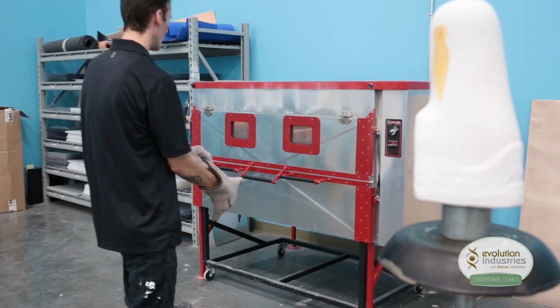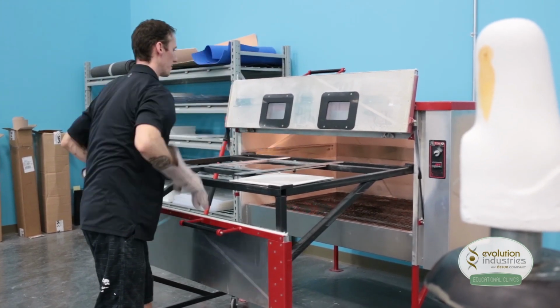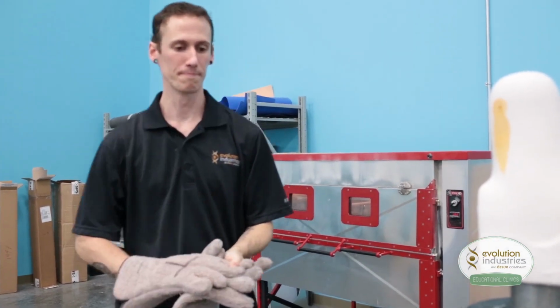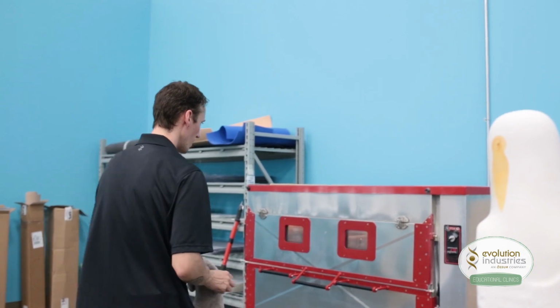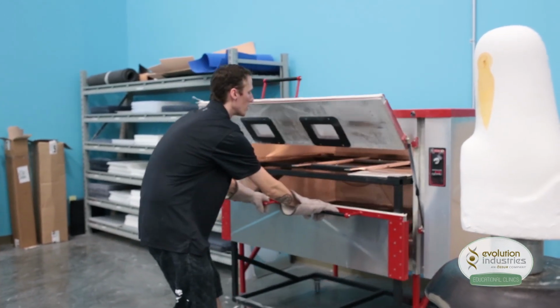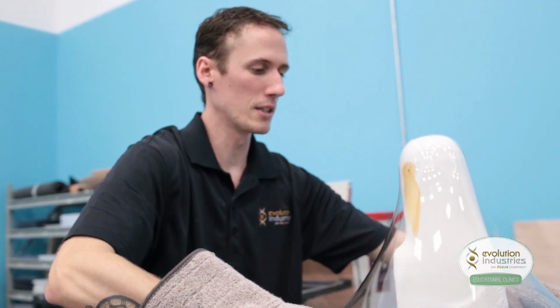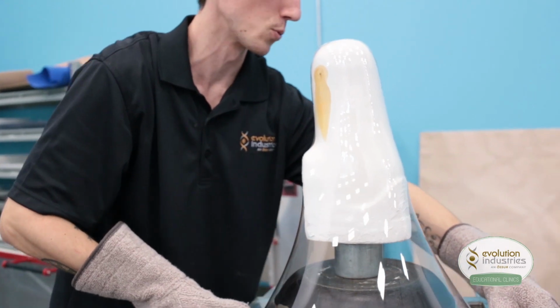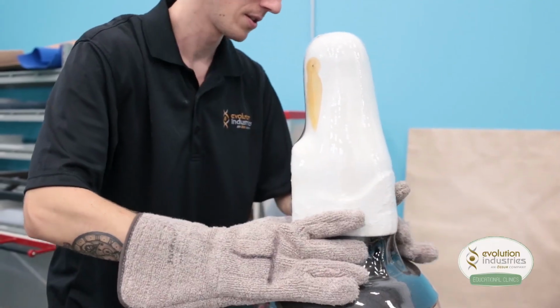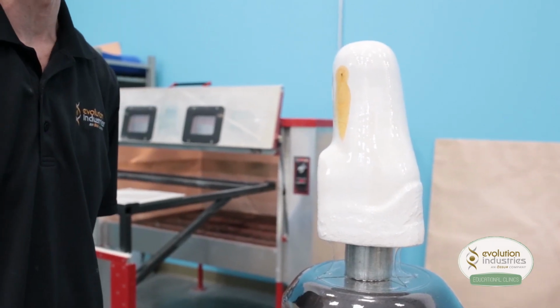After 1.5 minutes, I'm simply going to flip it. And after 1 more minute, it will be ready to pull. Plastic is ready to pull. I will turn it over as I pull it onto the cast. And I'll give it about a 90-degree turn, and that'll help eliminate any wrinkles as well. Sweep the plastic down. And I let that cool for approximately 1 minute.